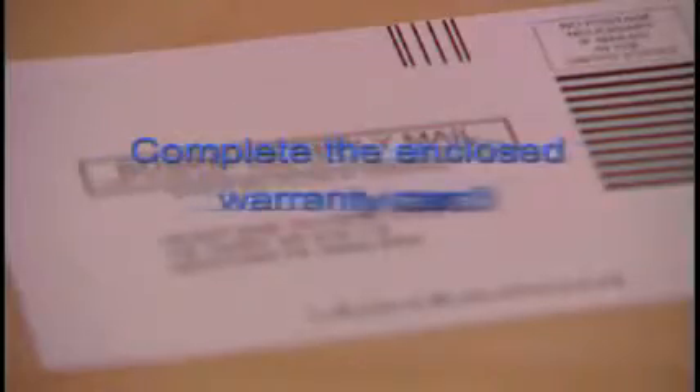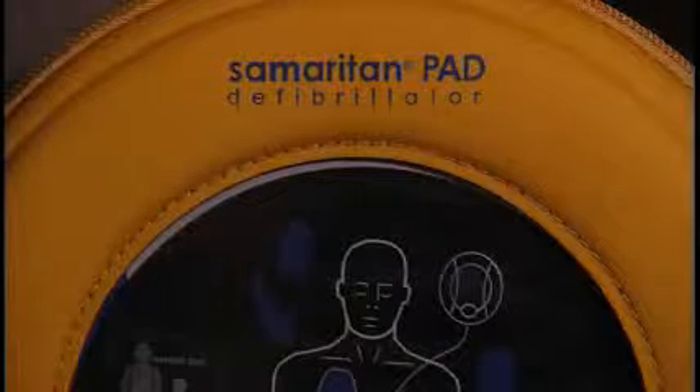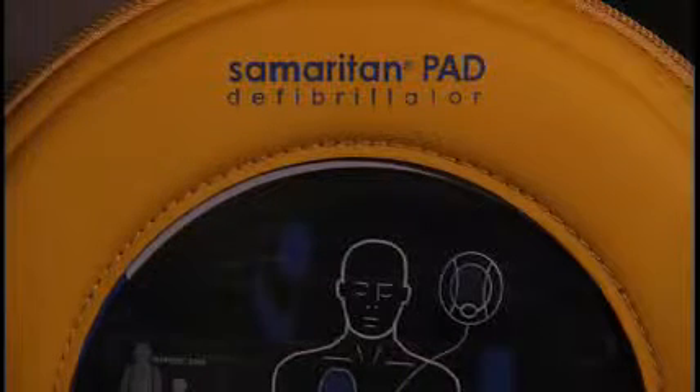Be sure to complete the enclosed warranty card and mail it in to Heart Sign to activate the warranty. Periodically check the status light indicator and ensure it is flashing green.